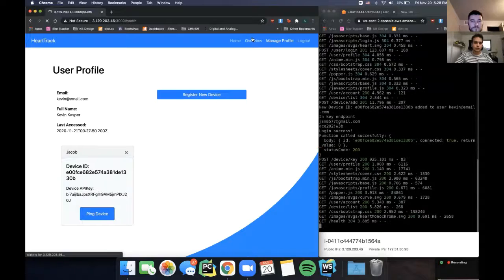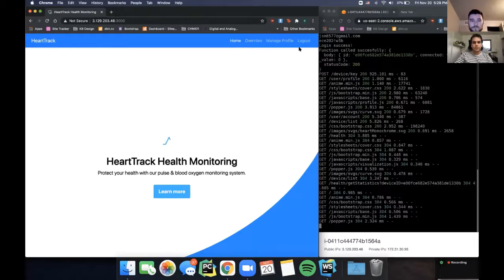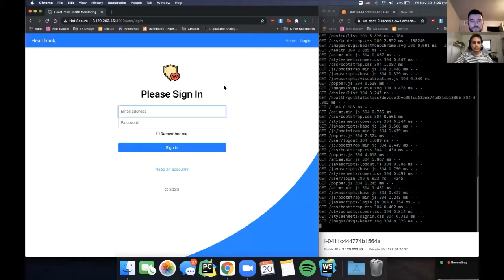I'm going to show you the overview page right here. And once we have some readings, they will be displayed on this page. Our navigation bar is dynamic, so if you log out, you'll not be able to access any of those pages. So I'm going to go ahead and log back in, and I'm going to hand it over to Jacob now.